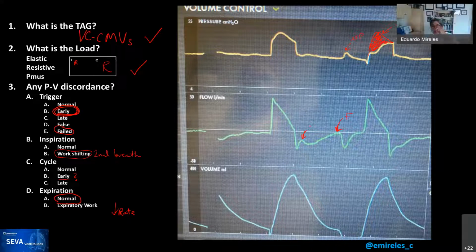Right. The other point would be that when it triggered a spontaneous breath, it didn't cycle it by flow, it cycled it by time. So it would not be either under those circumstances. Yeah. So can the flow acceleration be selected with a decelerating ramp on the Servo U? Rob? Yes, I already answered that, yes.